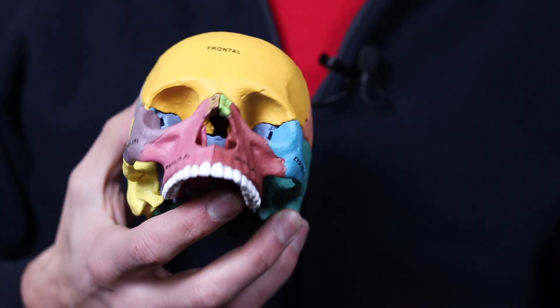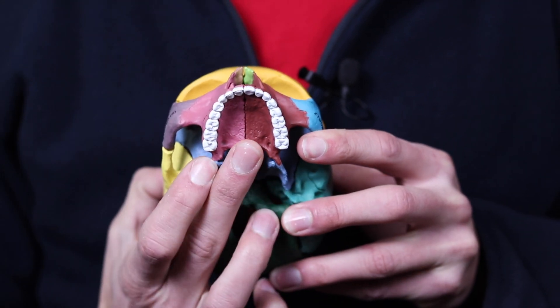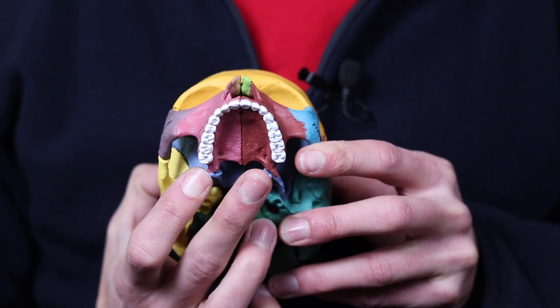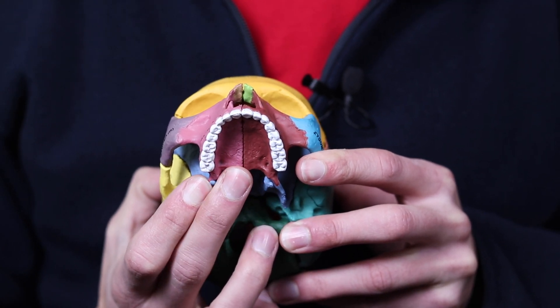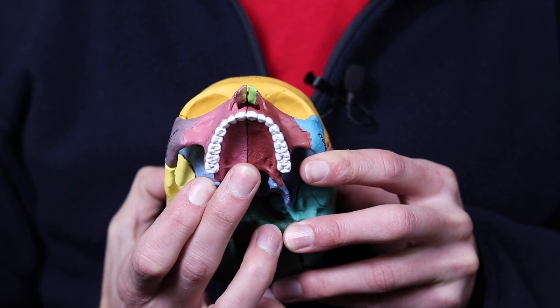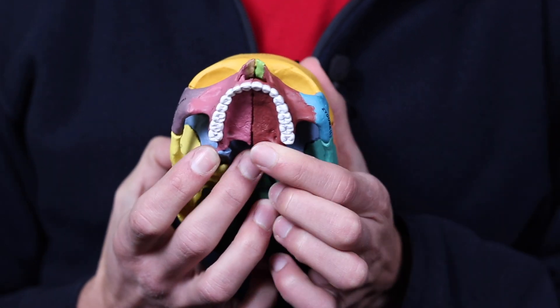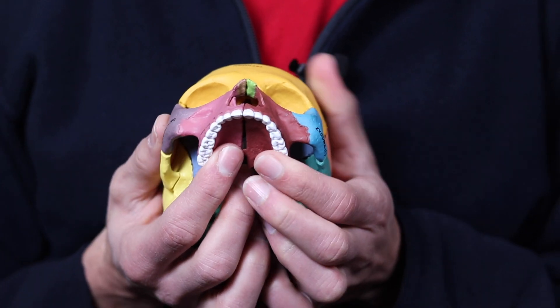MSE is installed right here at the back of the maxilla. It is screwed in with 10 millimeter screws on either side of this suture called the mid-palatal suture, and it has a jack screw. When that jack screw is turned, the suture actually splits like this.